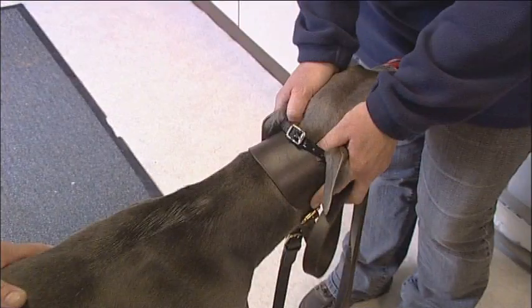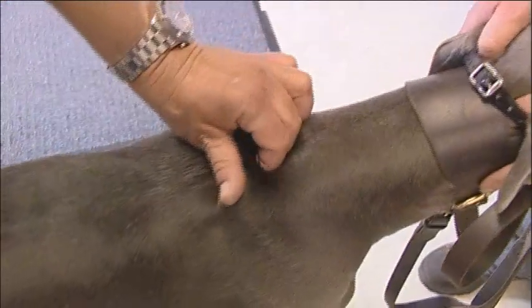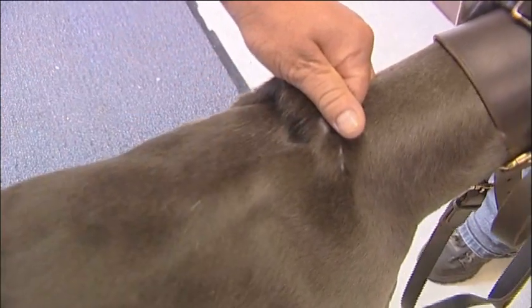The trainer or kennel hand should hold the greyhound's head as horizontal as possible to make microchipping easier. To identify the site to be microchipped, place your thumb across the top of the shoulder blades, grasp a flat platform of skin and raise a small tented area to identify the site.